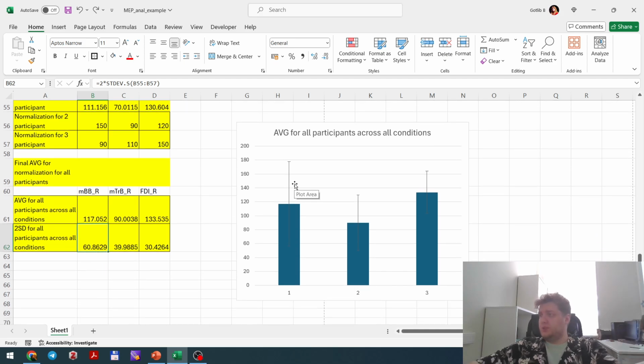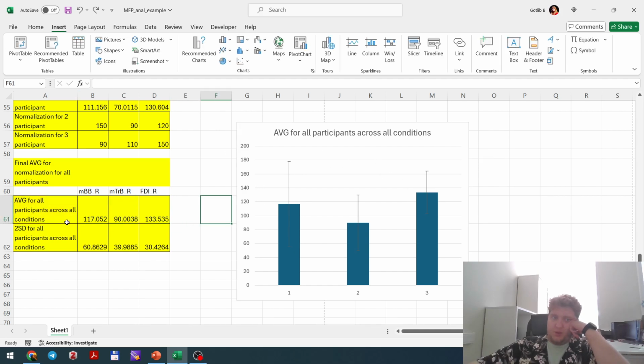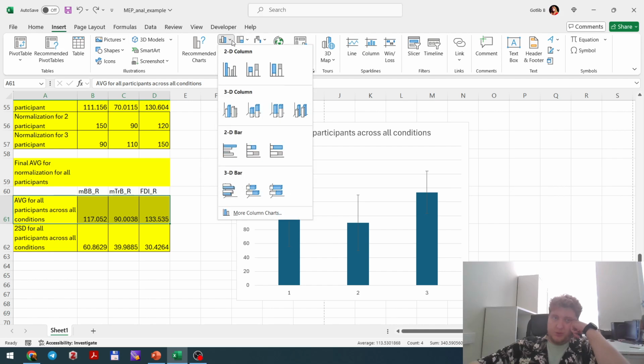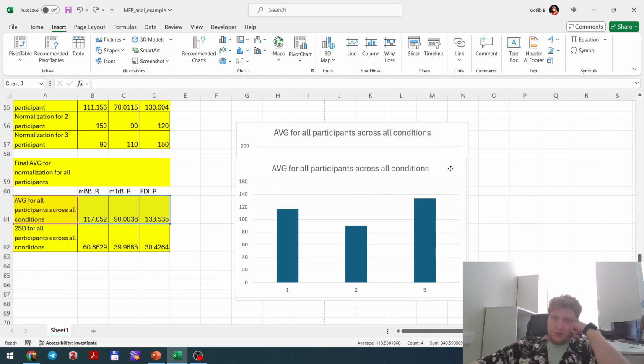Then we need to plot it. This is the simplest way to look through the data before the statistics, just to understand the trends and other things. For presentations, for example, this is a good approach. Firstly we do this, then we use insert, searching for the plot, as I did here before.